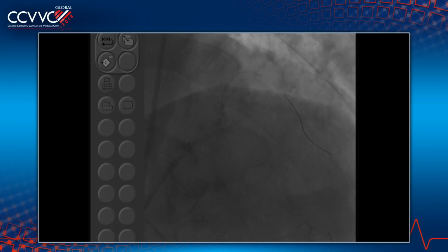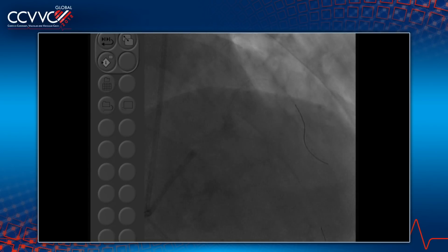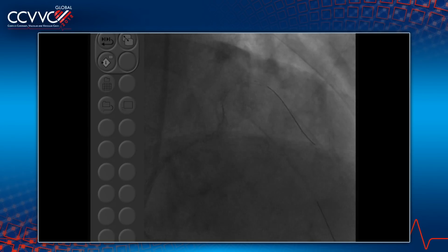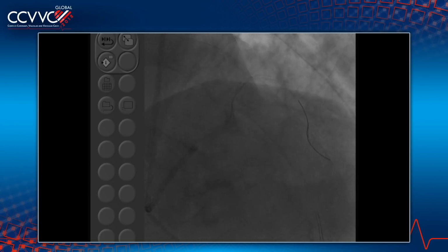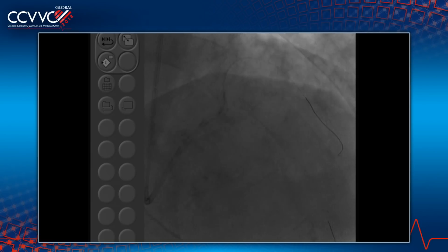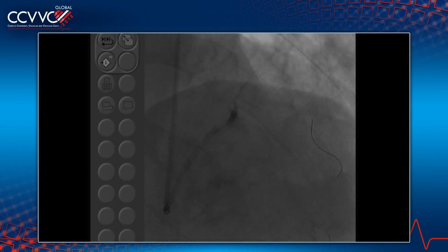I guess a lot of people would say, why aren't you guys imaging here if you're so worried? I mean, I know it's a 94-year-old patient. Trying to get imaging done, if you want, will be at the end, not when we have this blood pressure. Do you need imaging? I will always do IVUS at the end. It's much easier to recross. At the end, definitely image, particularly since these are very large vessels.